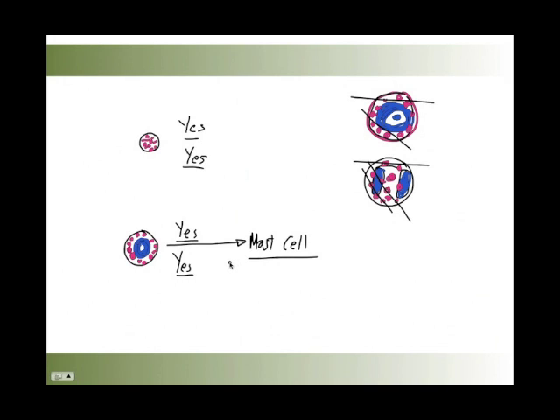So one of the take-home messages here, apart from being able to identify this, is that the problems in identifying a mast cell versus an eosinophil come with problems in interpretation. There's always a gray area in interpretation, and understanding the limits of what you can say in the context of the stain and the preparation and the morphology of the cell is really where it comes down to in terms of identification. So practice, good luck, and have fun.